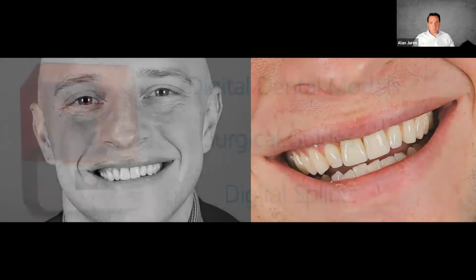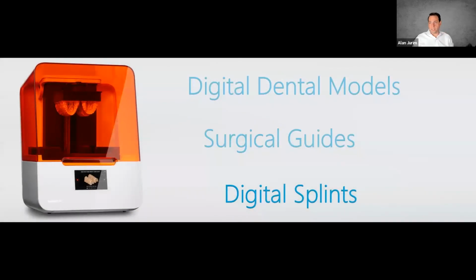So really good results. And the ability for all this to tie together happens with you being able to print the guide, whether it's in-house or you're going to have your laboratory team print it. The guide really allows for the workflows to be improved. So the last part we're going to discuss is about digital splints.